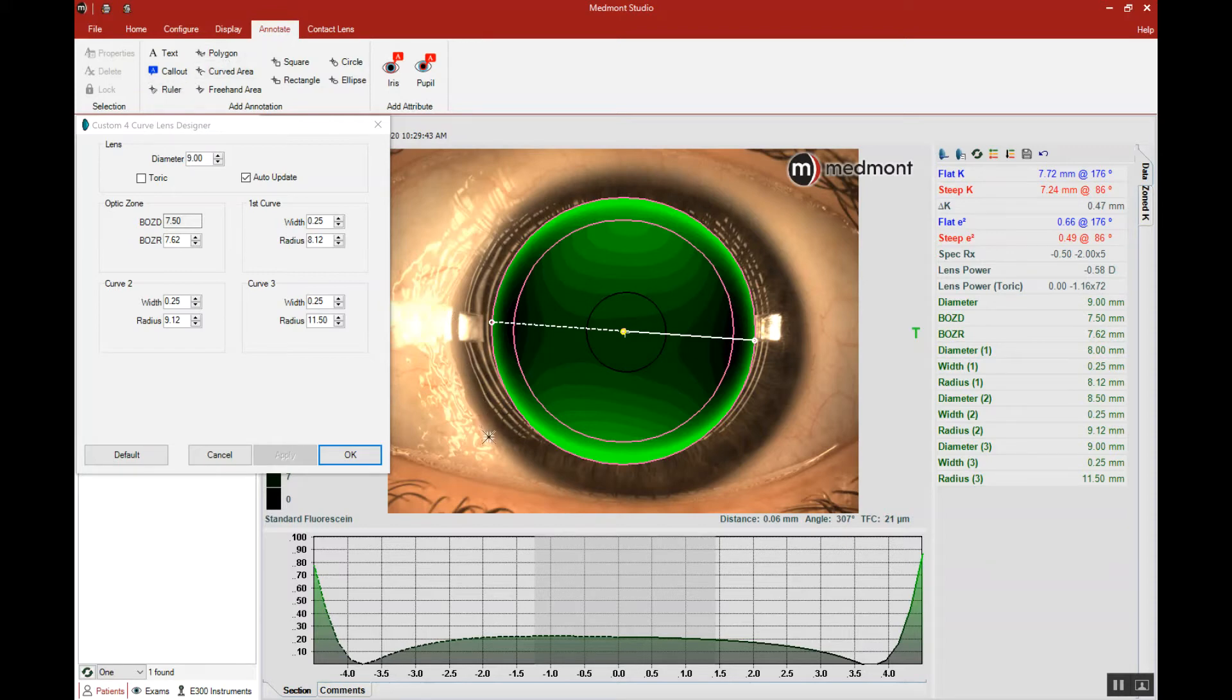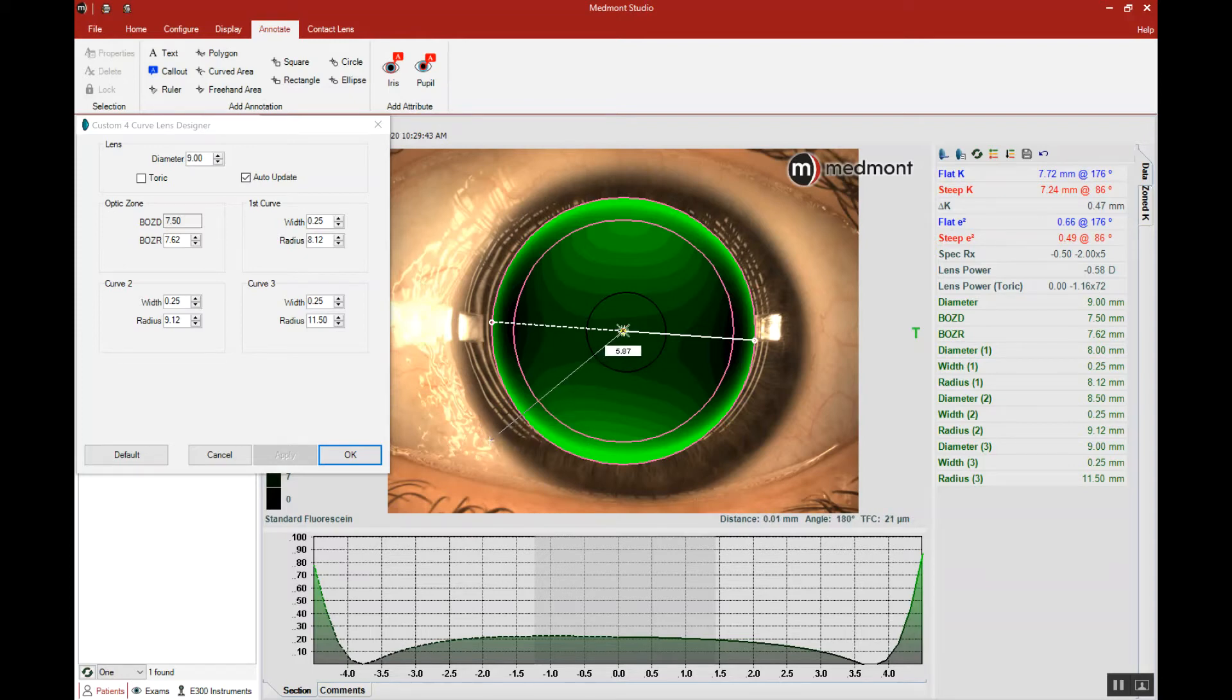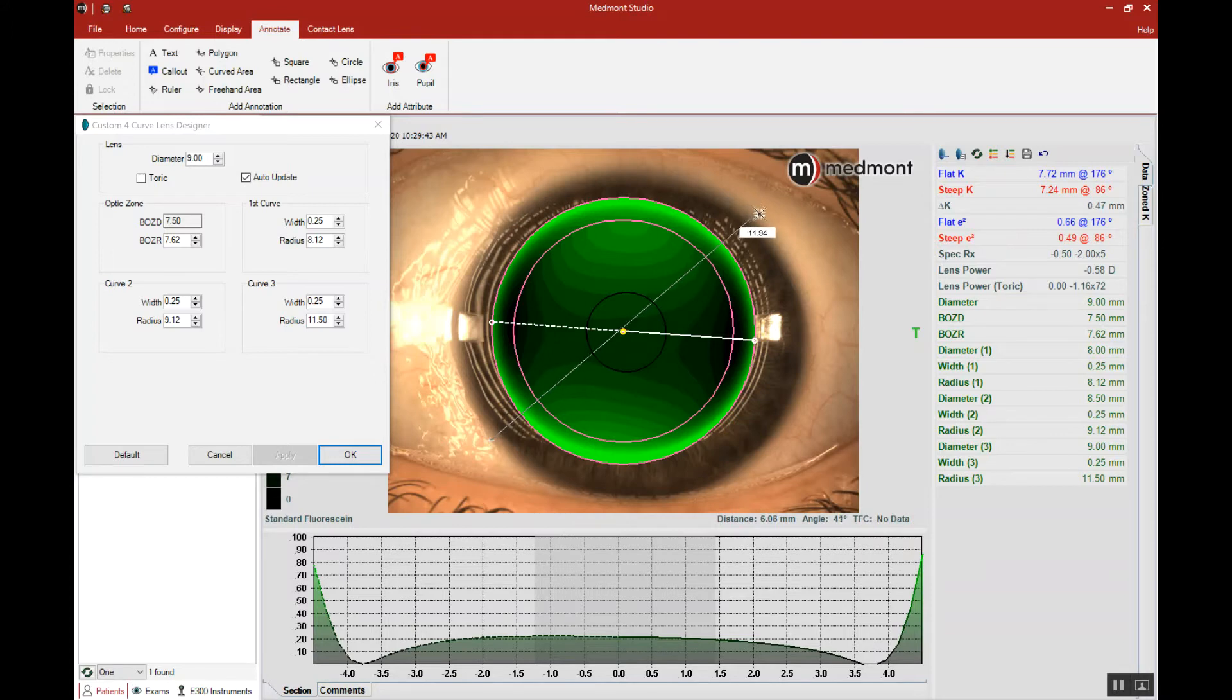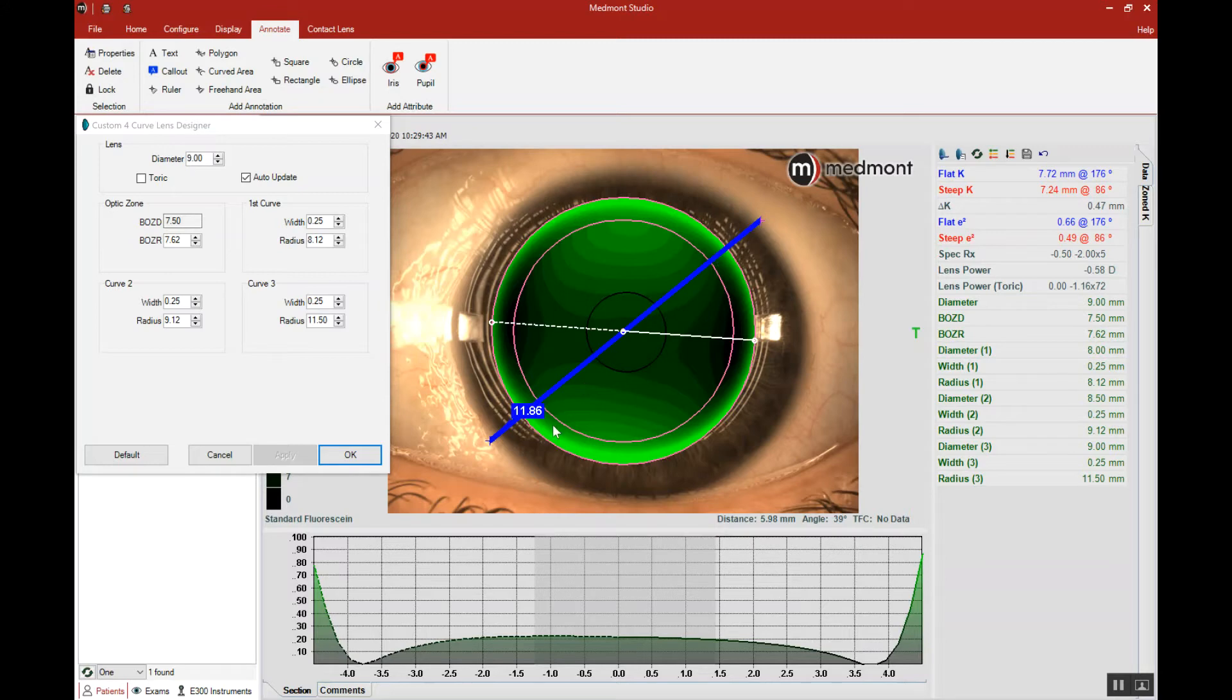Click your cursor on the visible iris border, drag the cursor through the center to the opposing side, click the cursor again, and that will tell you your visible iris diameter. In this case, approximately 11.86 millimeters.